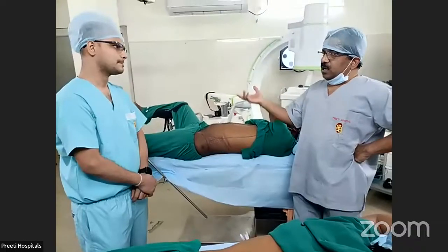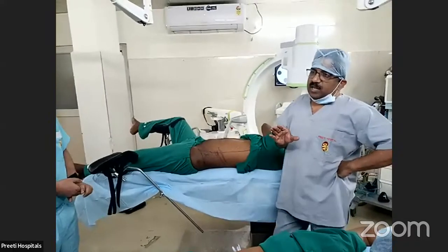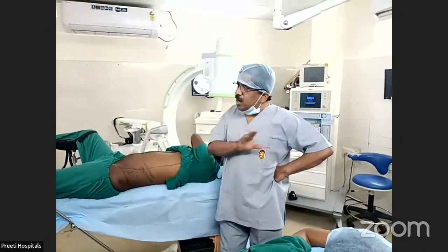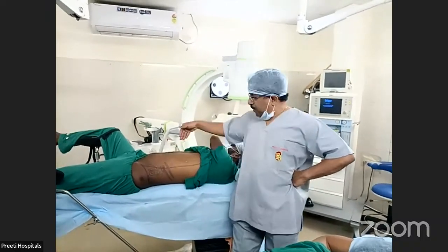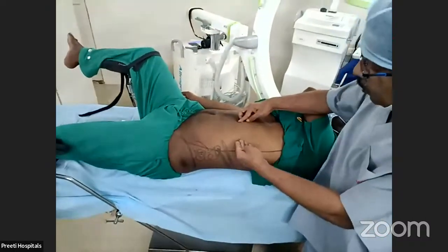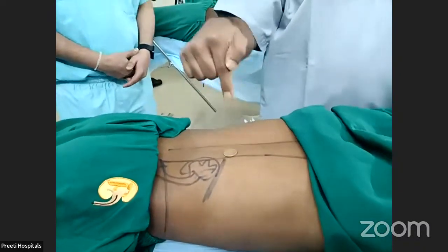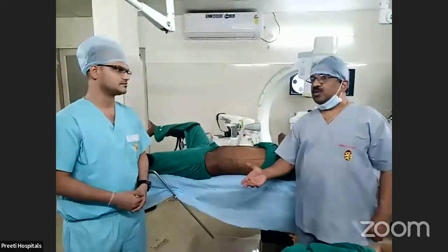Now with this, can we go to the cases? So now we discussed that middle calyceal puncture is very easy in supine PCNL. Middle anterior stone is absolutely suited. Some stones cannot be done with supine, or very rarely. For superior medially located stones, for example, if the stone is here, superior medial, how can you go from here, going here, going here? It may traverse. Whereas if it is superior medial here also, one vertical direct puncture onto the stone, feel it and just take it out, it is fine. There is no problem.